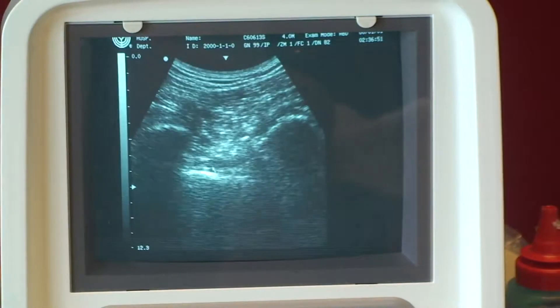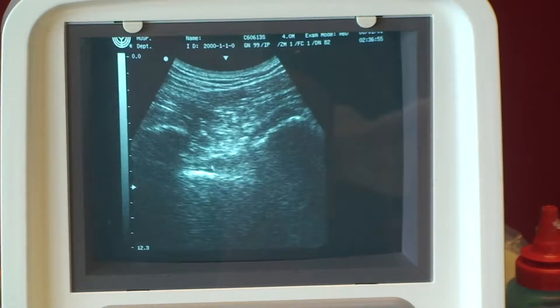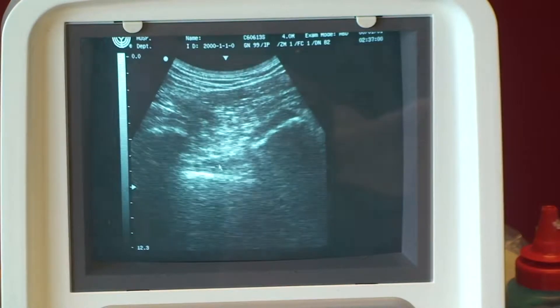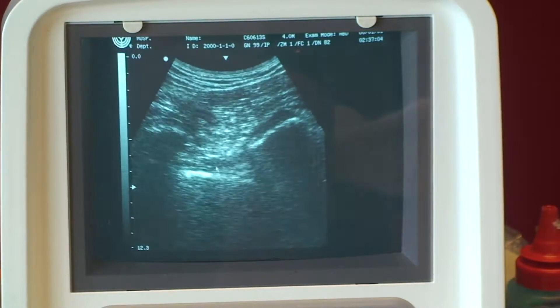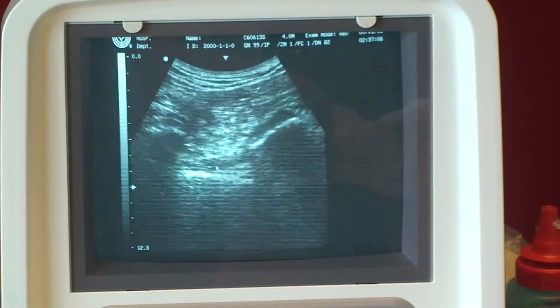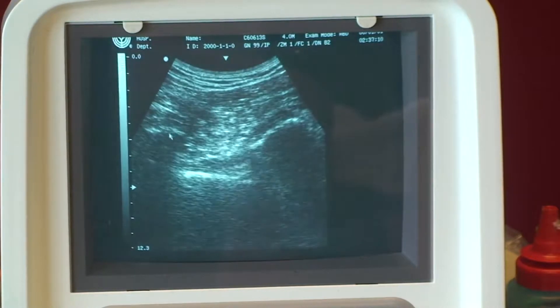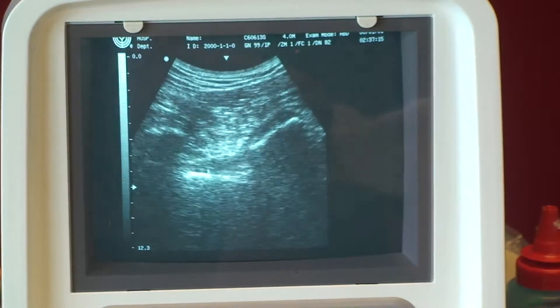On the screen, I had to make some adjustments to the image: I changed the frequency to 4 megahertz, altered the depth to about 12, and changed the gain. On the left you can see a sort of valley shape — the left side is the greater trochanter, then it dips down and that's the band of the quadratus femoris, and then more to the right of the screen is the ischial tuberosity.